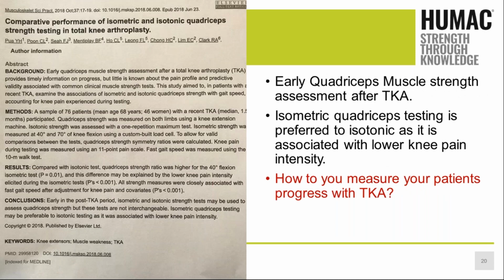So if we start with those patients that have gone through OA, and we know if they go long enough, they're going to end up with a total knee. And we all see a ton of total knees. So one of the things I love to do is I put them on the machine fairly early on in passive mode. We get them to increase their range of motion. We get great mobility, terminal extension, we get them into flexion, we get them into that eccentric unloading principle where they start to slowly activate the quadricep to help lower the leg down.